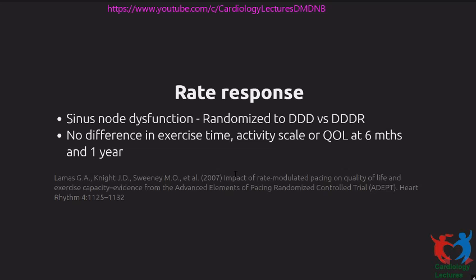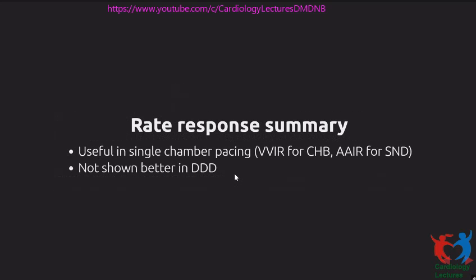If you're putting single chamber devices, like you're putting AAI for sinus node disease or VVI for CHB, definitely prefer a rate responsive device over non-rate responsive device. So especially if you put a VVI for CHB, clearly VVI-R has been shown to be superior to VVI in terms of effort tolerance. And actually, when you look at the DDD versus VVI trials, DDD is superior to VVI in heart block, but DDD has not been shown to be superior to VVI-R. So adding rate response in the ventricle for patients with complete heart block definitely is a big improvement. So always consider rate response when you put it in the ventricle.